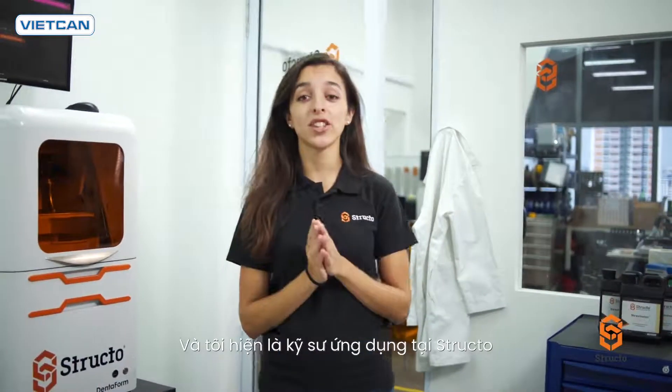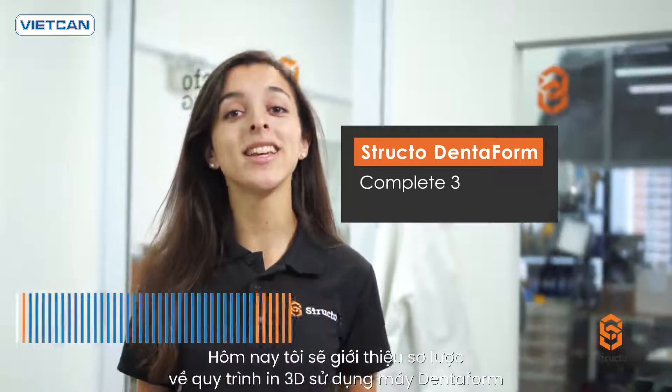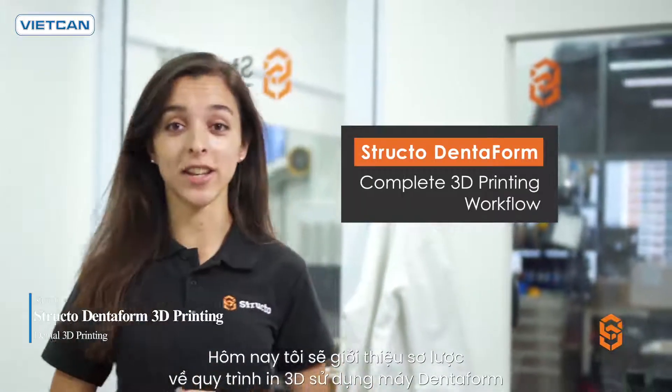Hi, my name is Sarah and I'm an application engineer here at Structo. Today, I want to give you a quick look at a complete 3D printing workflow using the Dentiform.